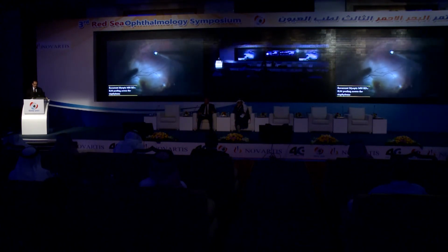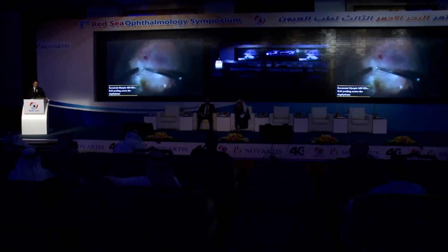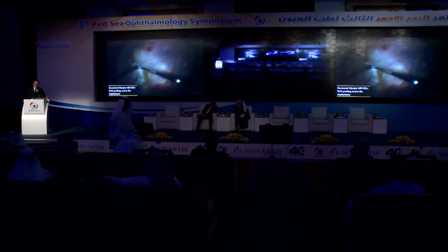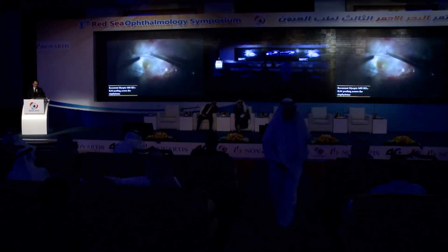This is also a recurrent case of macular hole, retinal detachment, and the internal limiting membrane was not removed, and the posterior hyaloid was removed. And again, we tried to remove the internal limiting membrane using the same principle of always working toward the center of the macular hole and trying to detach the internal limiting membrane to the edge of the staphyloma.